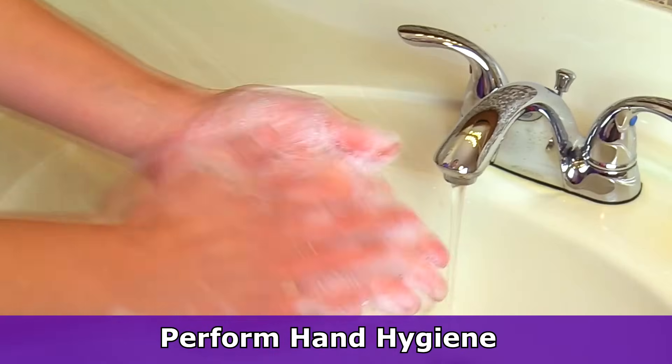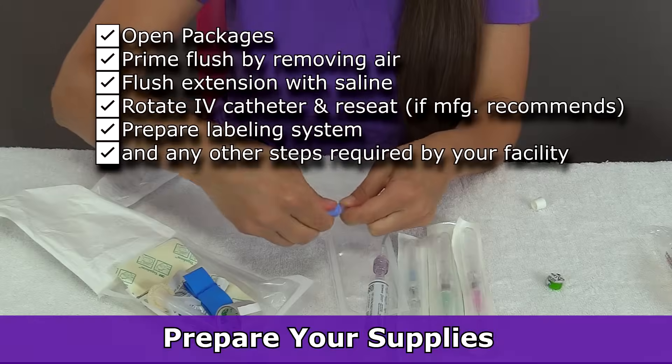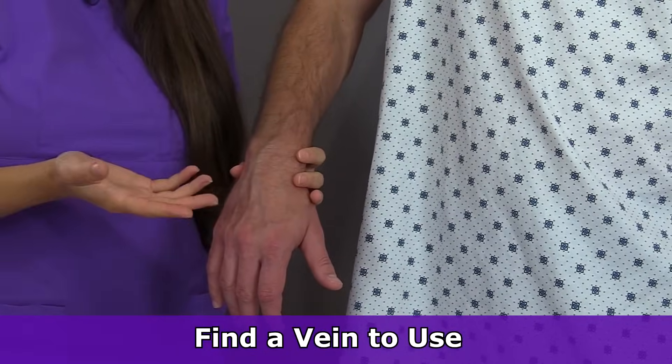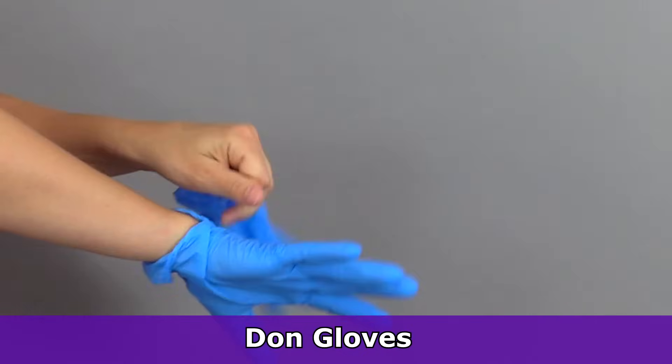Before inserting the IV, first what you want to do is gather your supplies and perform hand hygiene. Then after that you want to prepare your supplies and find a vein that you want to use on your patient to actually insert the IV in. Once you have done that you'll perform hand hygiene, don gloves, and then prepare for insertion.